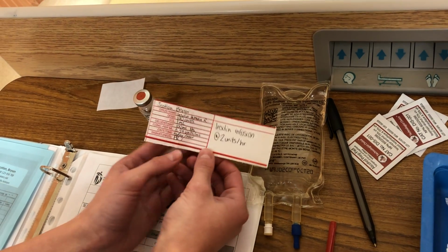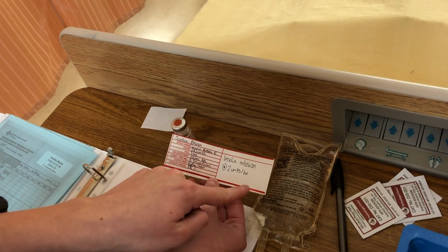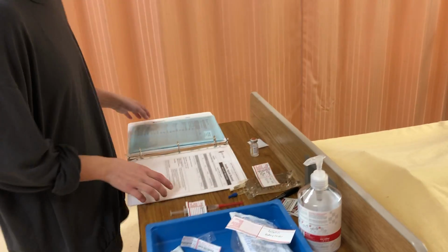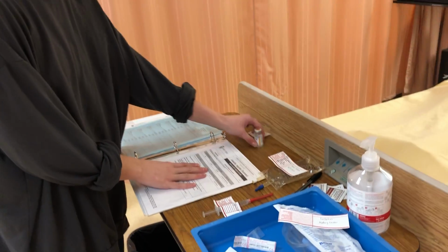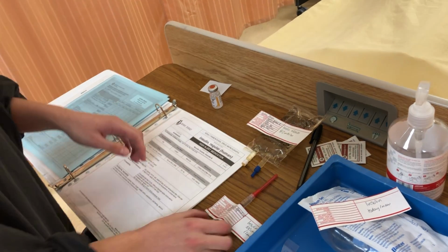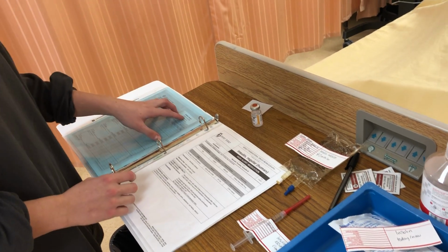Today and now, and my signature, and we'll get another nurse signature, and just our infusion at 2 units per hour. So now that my medication is drawn up, I'm going to do a second check. So I have the MAR, the PDM, the medication vial, our medication bag, and then our syringe that we've drawn up. So we'll do name, Scotland Bryson.